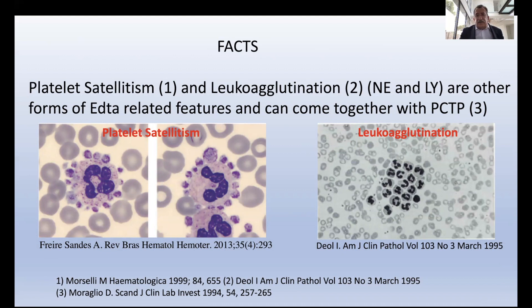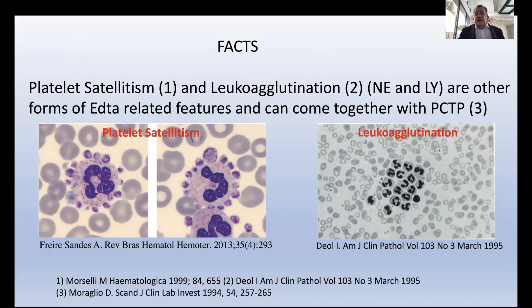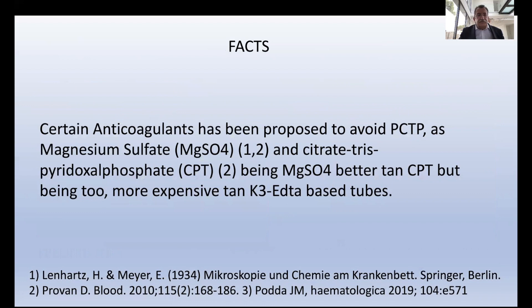Platelet satellitism is the same type of interference due to antibodies against crypto antigens, where platelets surround neutrophils causing an abnormally low platelet count. You can also find EDTA-dependent leucoagglutination — a rare phenomenon. I witnessed a case at the Mayo Clinic with Robert Pierre, later published in the American Journal of Clinical Pathology, and personally detected only one case in France around 1999. Warming, mixing, or adding aminoglycosides can prevent or dissociate this leucoagglutination.